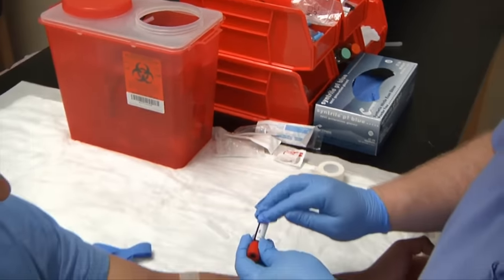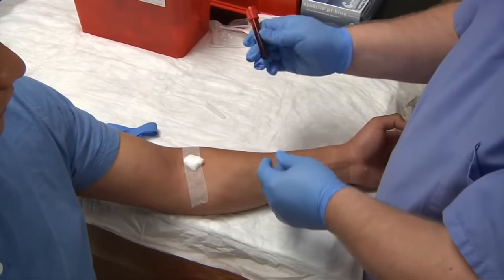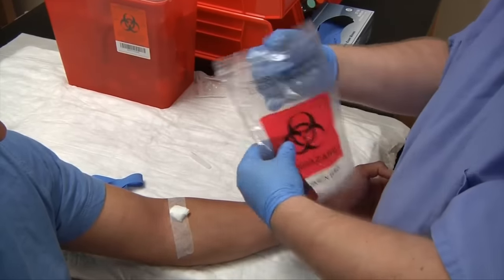Go ahead and put your patient's name on the tube, along with the date, time, and your initials. Place it into the biohazard bag and send your specimen to the lab.